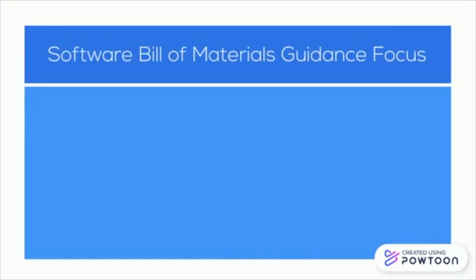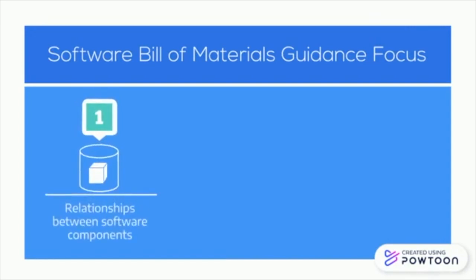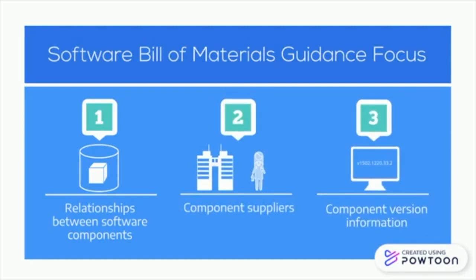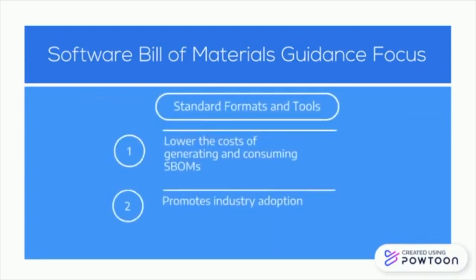Software bill of materials guidance should focus on software components in medical devices, including data on relationships between components, on component suppliers, and component version. Guidance should also promote the use of standard formats and tools, which lowers costs and promotes industry adoption.